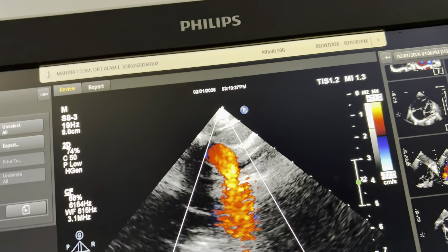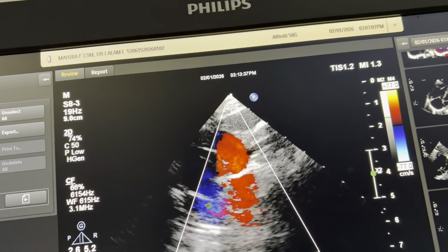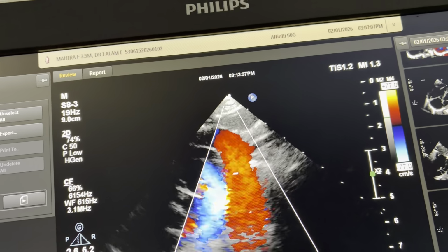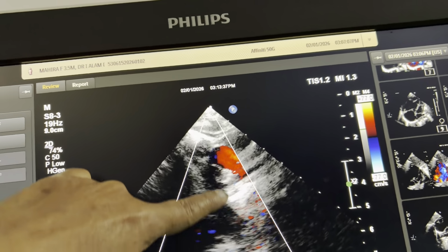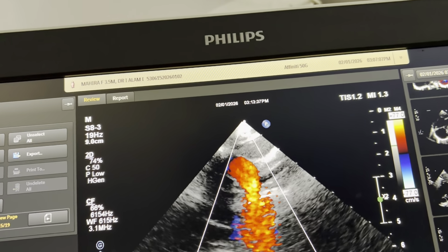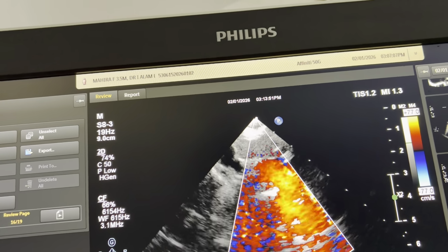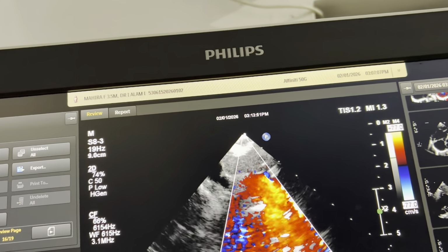The vertical vein is the vein that comes from the pulmonary venous confluence. All four pulmonary veins join together to make one chamber. From there one tube comes and joins the left innominate vein. That tube is called the vertical vein, and this flow represents the vertical vein. There is no flow obstruction in this scenario. Again you see this one. This is flow through the vertical vein.